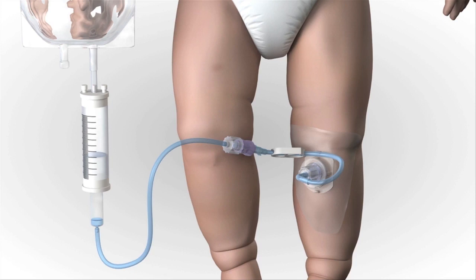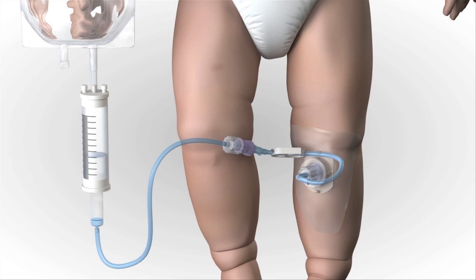Compartment syndrome is a serious complication that can result from unrecognized infiltration or extravasation.